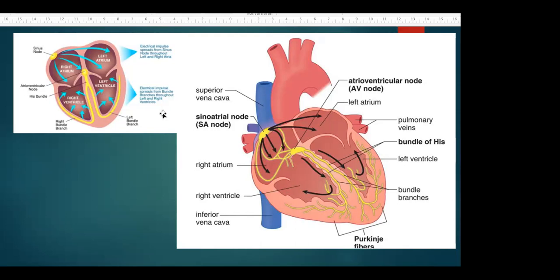There's another method of pacemaking for the ICU, for cases where the life of the patient depends on you because you don't have any cardiac surgeon around, and you want to transport the patient from Kisumu to Nairobi or from a rural area to Nairobi. There's a way where you can use electric wires.